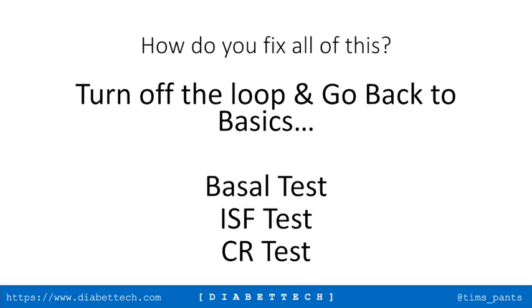Just one question. How do you define for you, or in general, if it's not working? Because normally, I'm not sure about it, but the loop working with 90% time in range between 4 and 10 millimole could be great, but could also be bad. So you have to make that decision for yourself, right? Is the loop working for you? Well, if your time in range is 40% using the loop, then probably not.